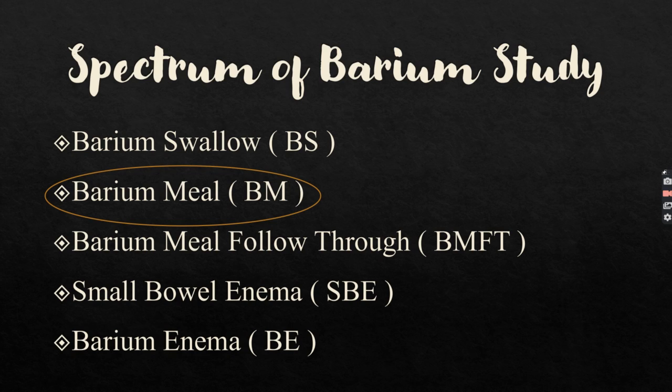And this is a very important slide here, the spectrum of barium study. We have started the previous parts also with this spectrum, if you remember, and I'll advise you to please go back through those part 1 and part 2 videos related to barium studies if you have not attended, and if you have already gone through those videos, very good. Now in this video we'll start with the barium meal part. Barium swallow we have already covered in part 2.